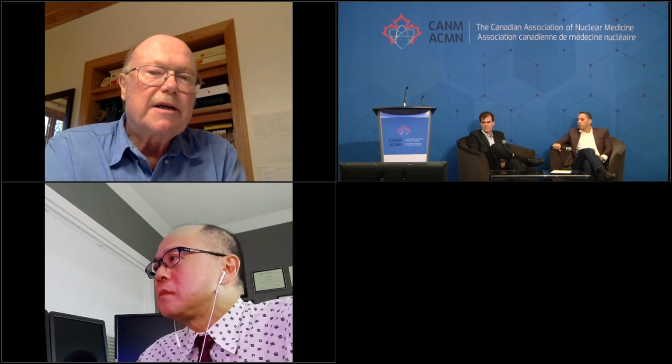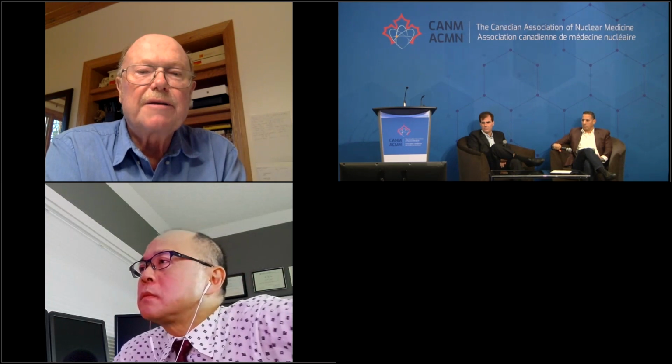The situation for looking at treatment response is totally different. As I showed in that slide, the MR enhancement extends into all the adjacent soft tissues, and it doesn't allow you to use the criteria that we developed for interpretation of PET. That is, infection is in the adjacent bone, soft tissue, or spinal canal, and if it's confined to the joint, then you're looking at mechanical inflammation. So MR is not good for assessing treatment response, but neither is white blood cell imaging or gallium.